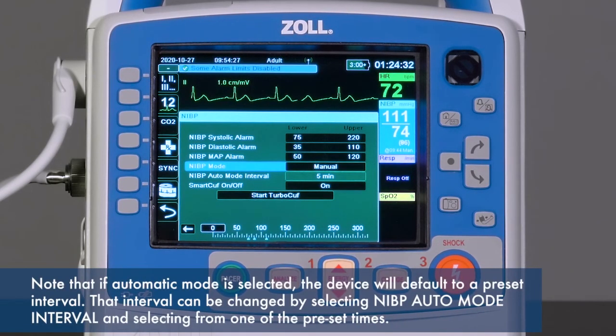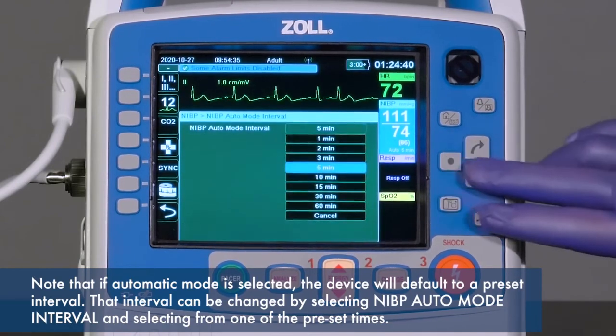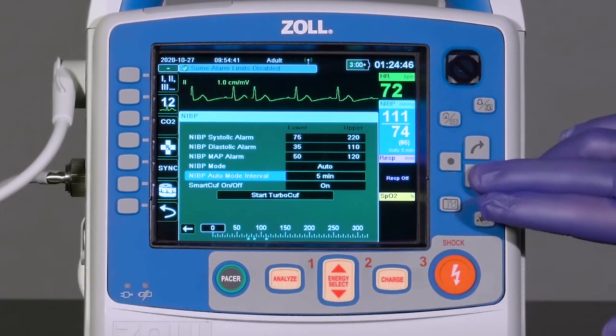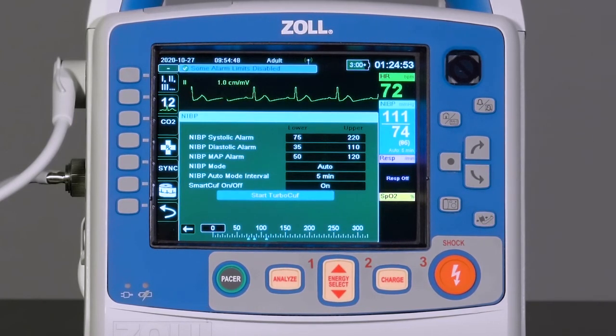Note that if automatic mode is selected, the device will default to a preset interval. That interval can be changed by selecting NIBP auto mode interval and selecting from one of the preset times. The Smart Cuff technology can be enabled and disabled through the menu, as well as the Start TurboCuff feature. If enabled, the X-Series will acquire as many blood pressures as it is able to in a 5-minute period, and then return to the previously used NIBP mode.